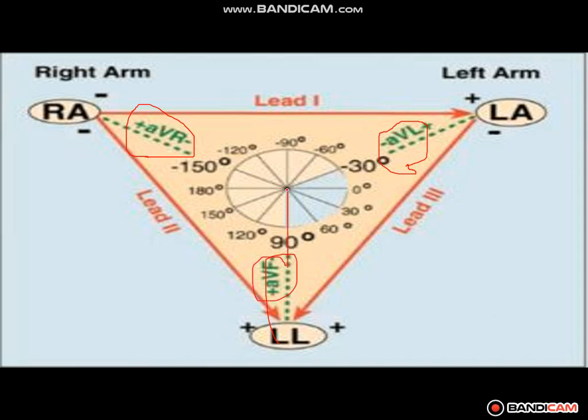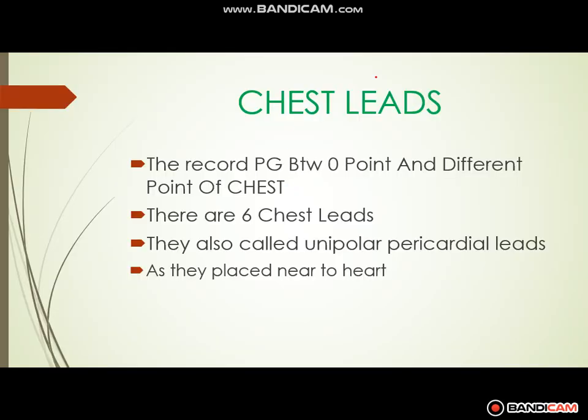Then you can see these leads. This is AVR applied to the right arm, then AVL applied to the left arm, and then AVF applied to the left leg.